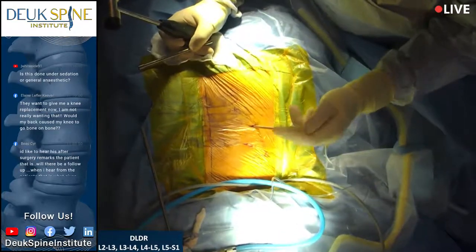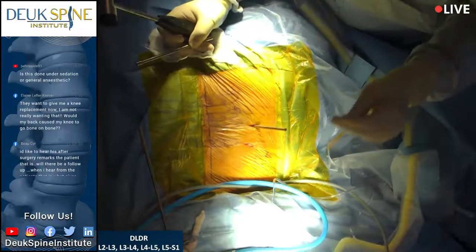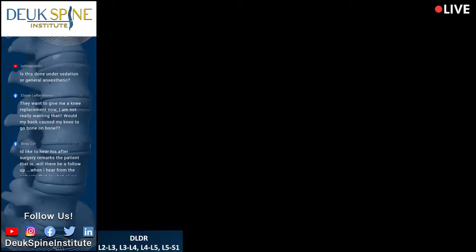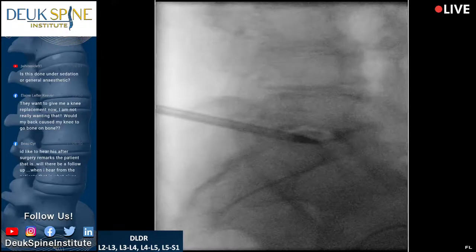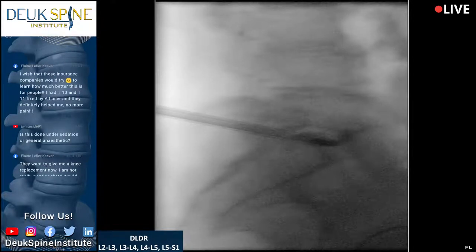All right. Well, I feel we're in the disc space, so we're getting the guide wire out, a little bent. And let's see what we got. So he's moving a little bit. All right. Next, I'm going to bring my tube down for the last time. And this is endoscopic spine surgery. For those of you who joined us late, this is a minimally invasive procedure. Just lay still. You're doing great.